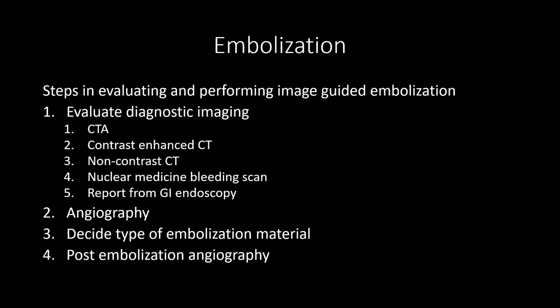So the first topic we're going to cover today is embolization, or stopping of blood flow to a certain targeted area. This is something that comes up almost on a daily basis, definitely a couple times a week, and lots of reasons that interventional radiology would be doing embolization.